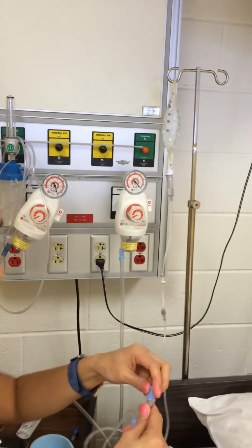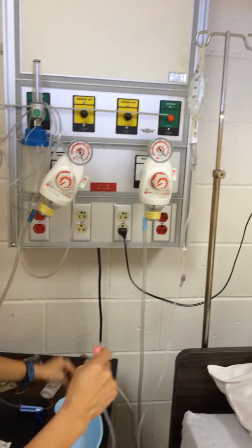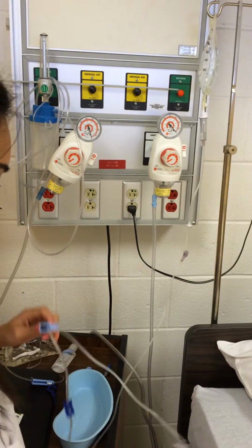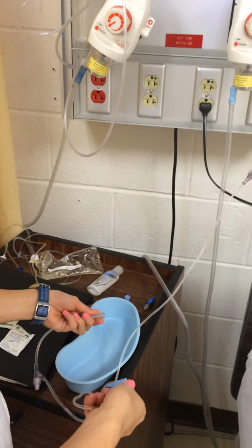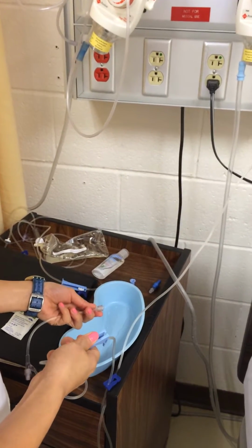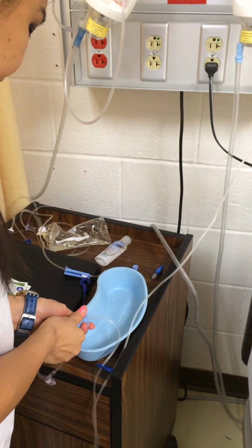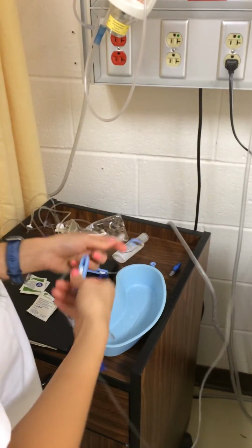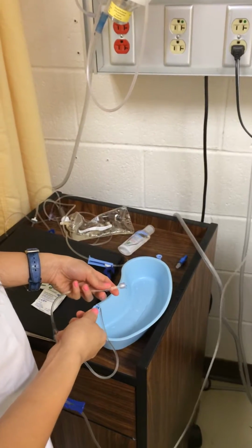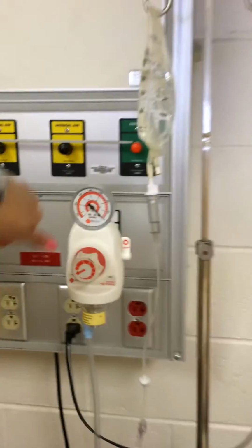Okay, I open it. So make sure there's no air. I have to unclamp it first. And I will do 15 drops per 15 seconds.